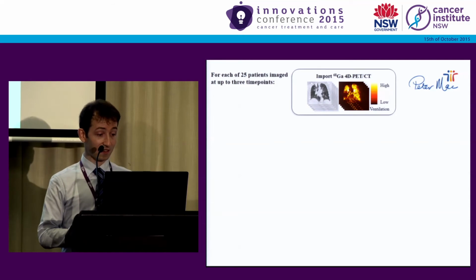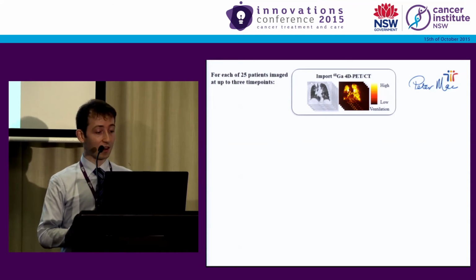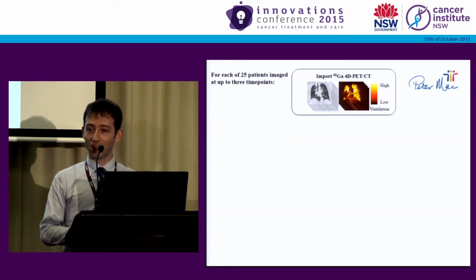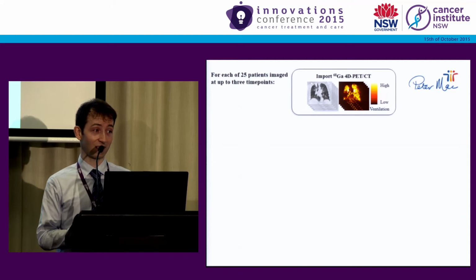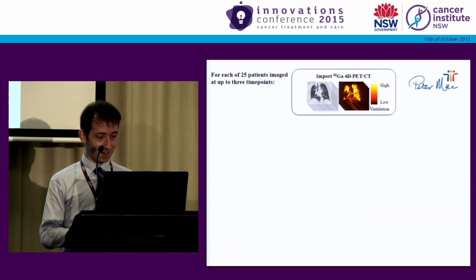We take, in this example, from Peter MacCallum Cancer Care Centre in Melbourne, they're getting 4-dimensional PET CT scans using ventilation Galligas PET on the same scanner, which is fantastic. We have the same patient, the same day, the same hardware used to obtain both the 4D CT and the nuclear medicine components of these scans. You would expect it's the perfect modality to compare against 4D CT ventilation.